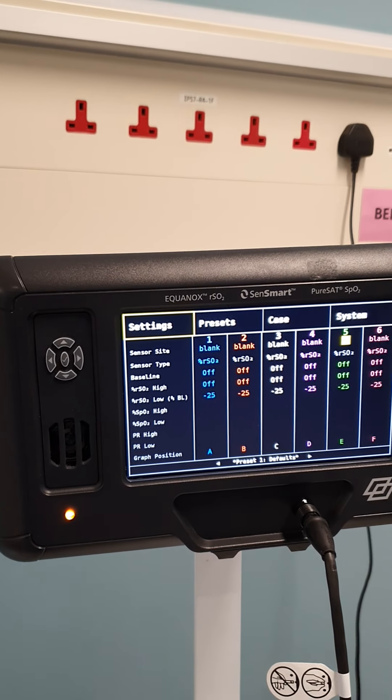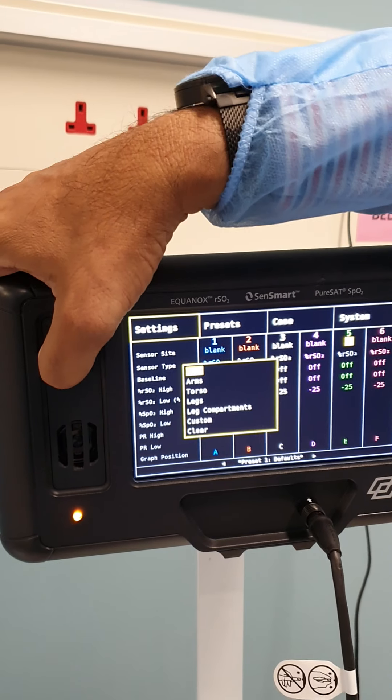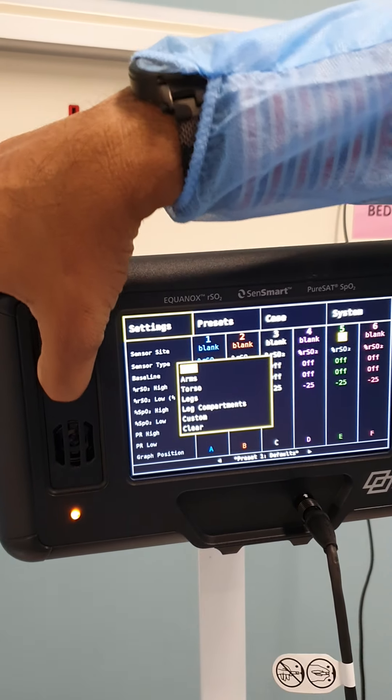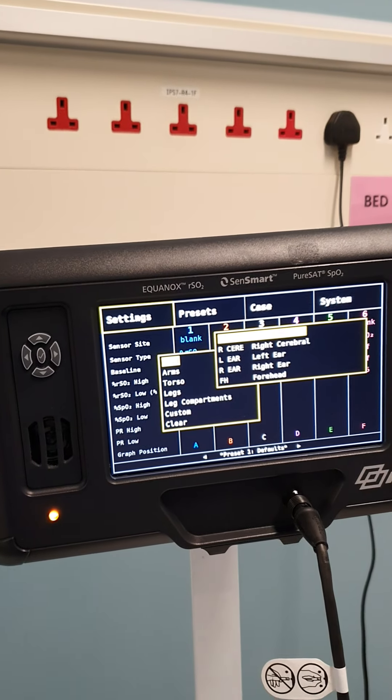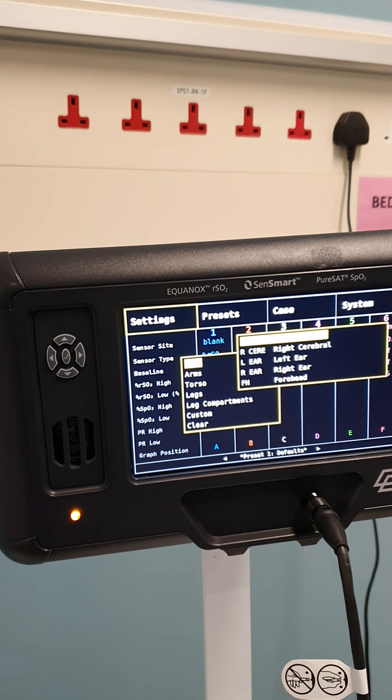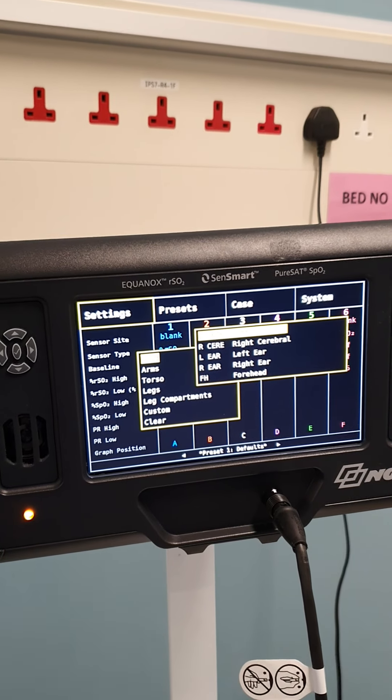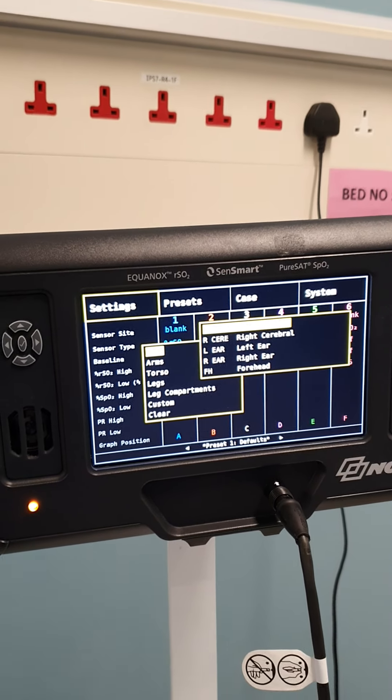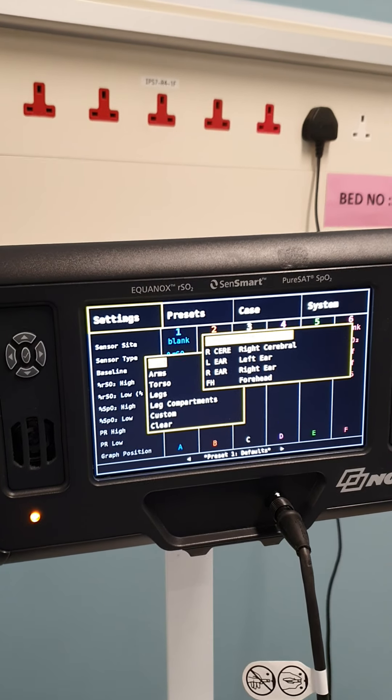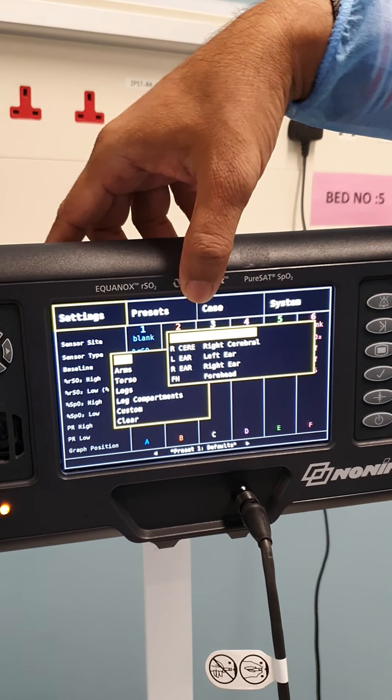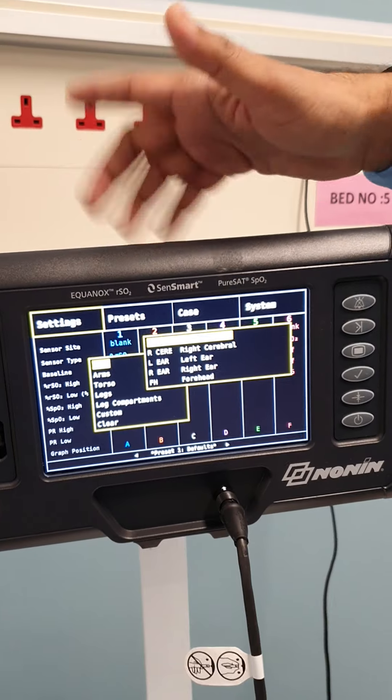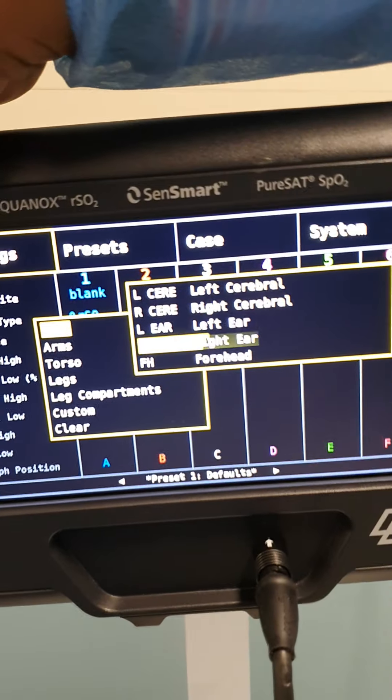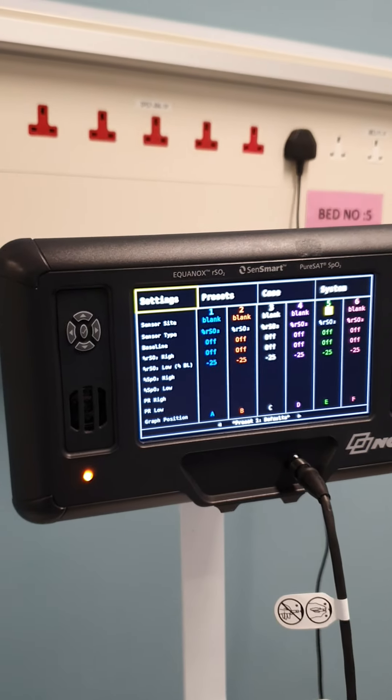You can see that the site is defined as forehead. But we can change the name, right? You can change it. You can change whatever name you want. If I select head, you have all these options. Either option you can have. But the name should be always forehead - FH. You can change it if you want to change the side, like left cerebral or right cerebral. Let's keep it as forehead for the demo purpose.